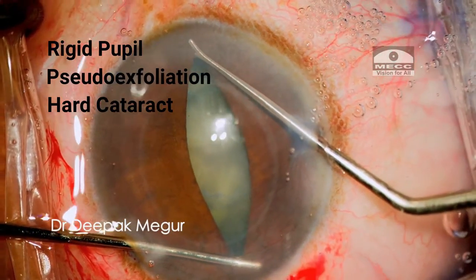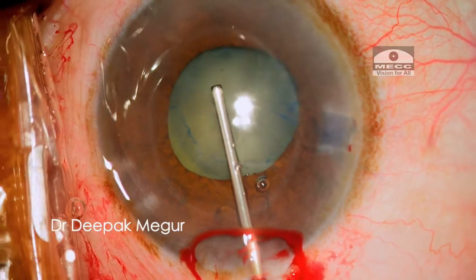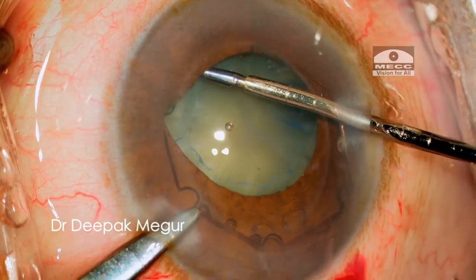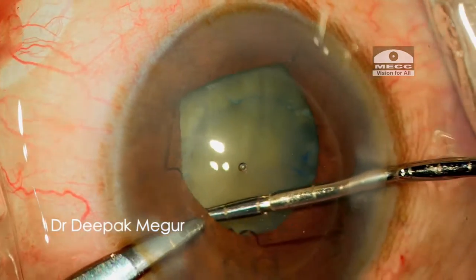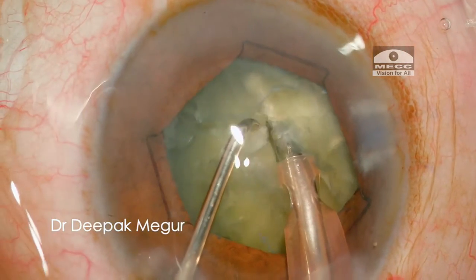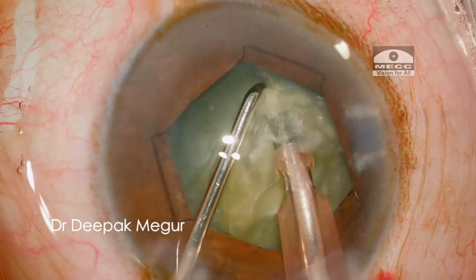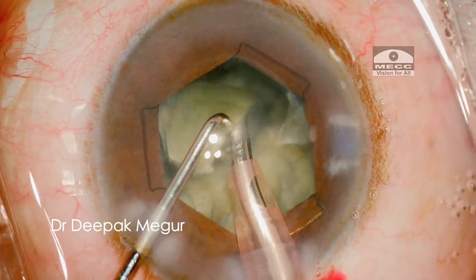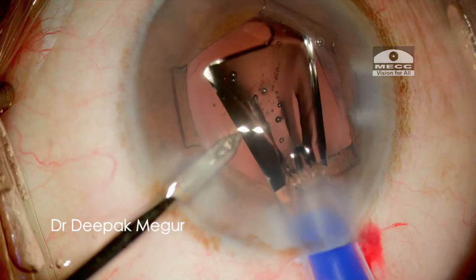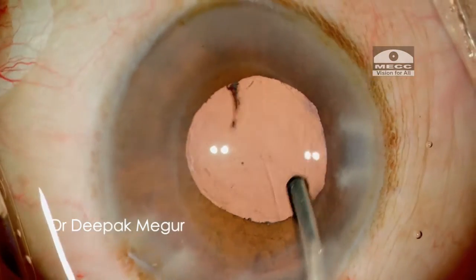A rigid pupil and a hard cataract. A bimanual stretch makes it easier to tuck the flanges of the BHEX. As we can see, the 5.5 mm pupil is more than adequate to emulsify even this hard a cataract. And once again, removal is so easy.